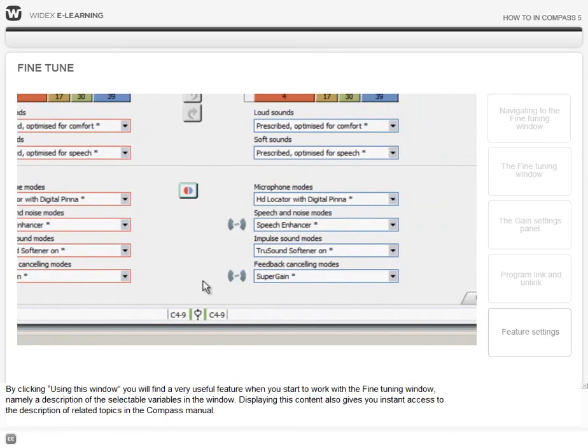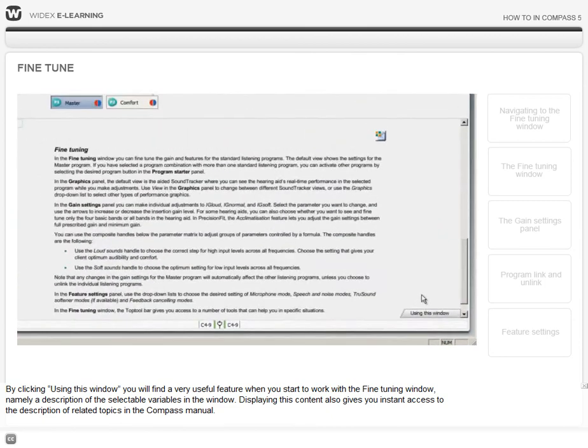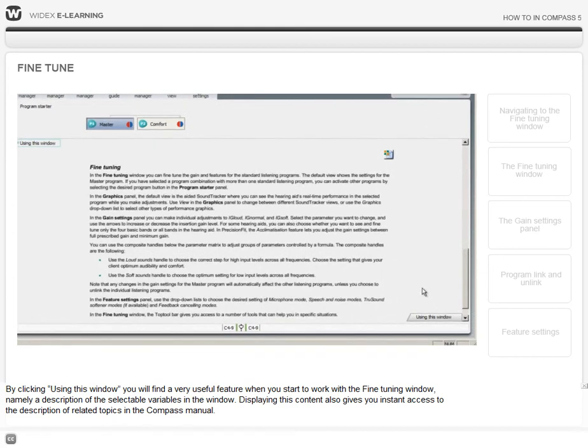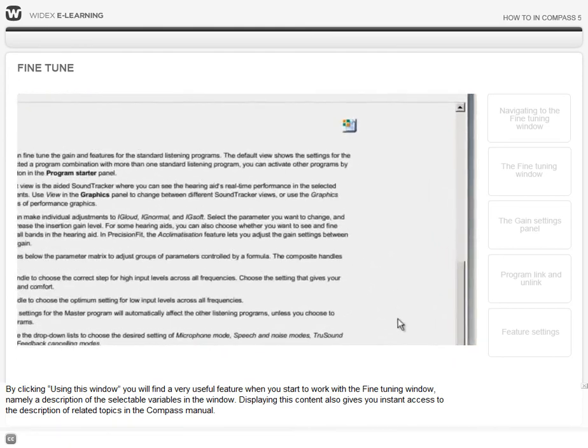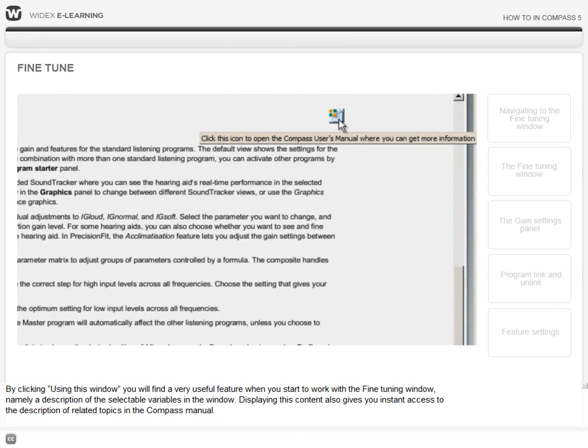By clicking using this window, you will find a very useful feature when you start to work with the fine-tuning window. Namely, a description of the selectable variables in the window. Displaying this content also gives you instant access to the description of related topics in the Compass manual.